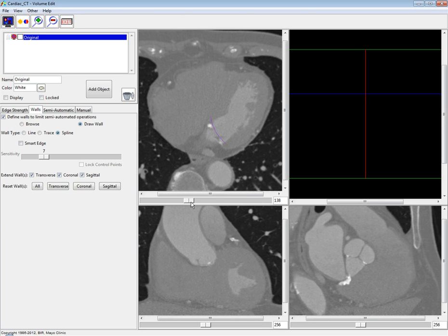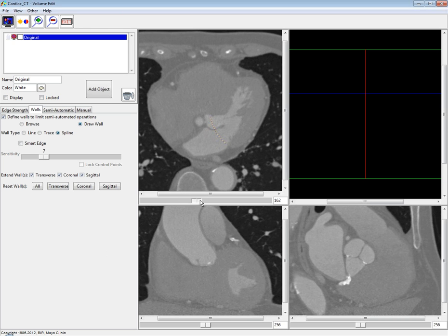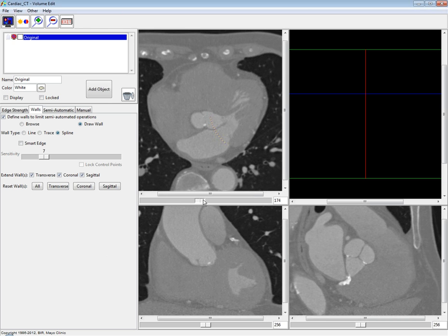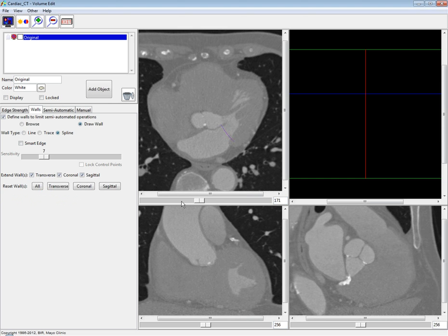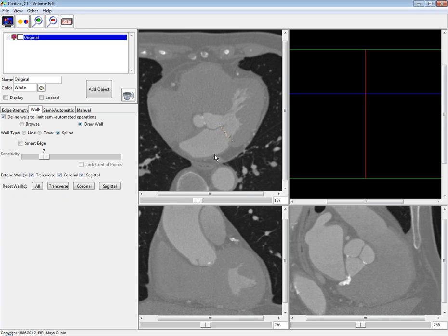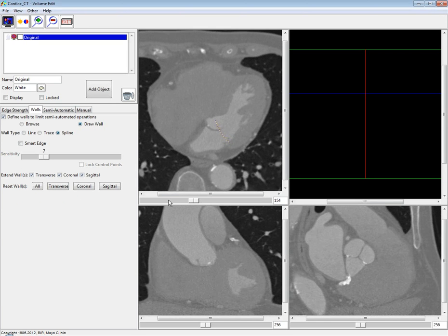Another capability with walls — available in Analyze 10.0 but worth demonstrating — is that if you define a wall on another slice in the same orientation, it will actually interpolate between the wall on the first slice and the second slice. I'm going to define a second spline here. We also have a smart edge option for the spline, which does edge detection to further refine and enhance the wall. I'll click apply, and moving back through the slices you can see it is interpolating between the first wall and the second one.